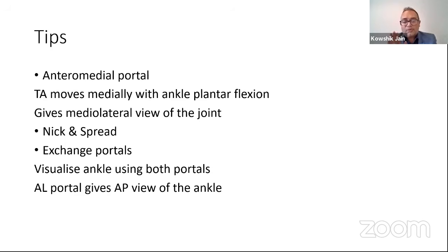When the ankle is plantar flexed, tibialis anterior, you will see, moves medially. So if you try and make a portal after this has happened, you will be way medial to where you should be, and you will actually struggle to get into the ankle joint. So, mark this portal before you distract. And when the distractor is on, you should manually try and dorsiflex the ankle joint. That will take the tibialis anterior away from where you're trying to make the portal, and following that, you should easily enter the ankle joint.